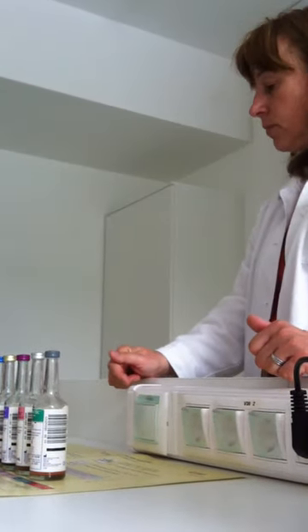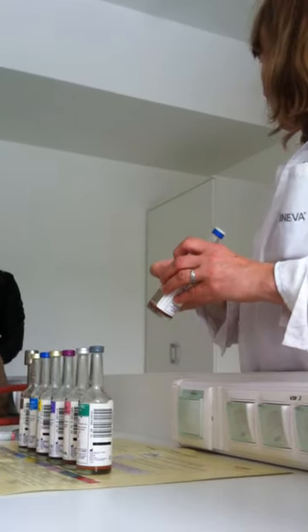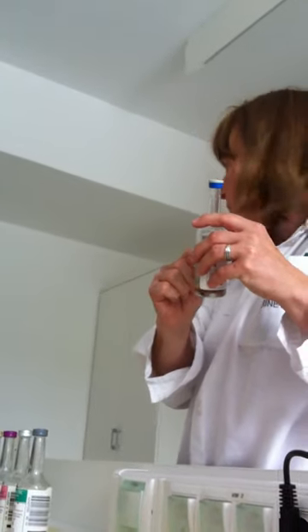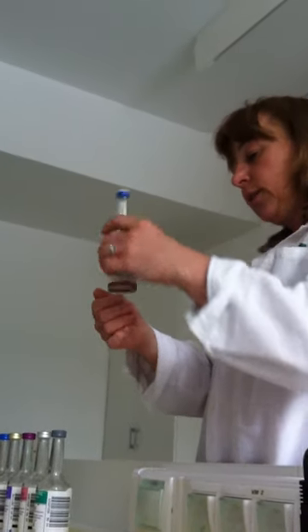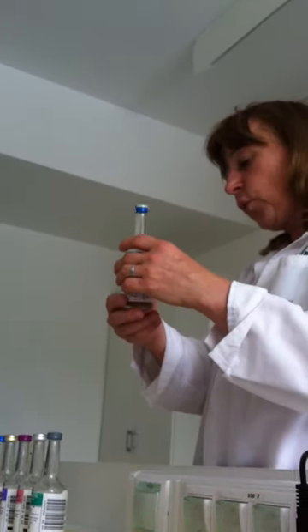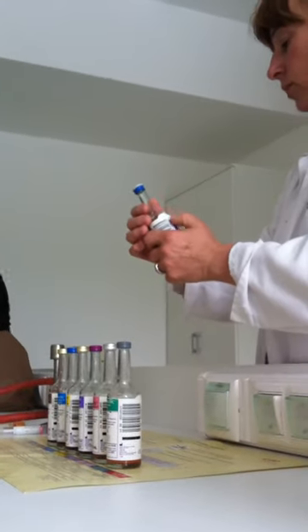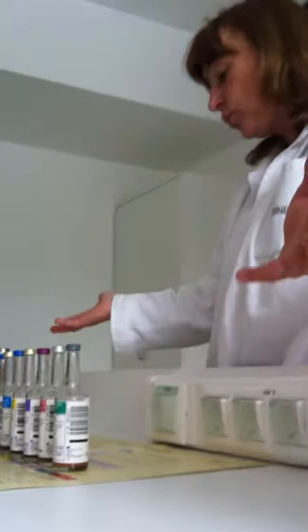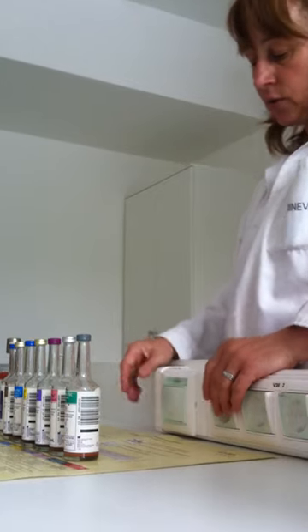How much should it be? Basically, there is a scale, and it is 10% of the solution, so you can calculate. It is very useful if you note it for yourself, and during collection you check, and if you reach this level, you stop the collection. So if you overfill, then it's a false positive. Or if the amount is less than appropriate, then it could be a false negative. So the amount is very, very important, and the other factors also.